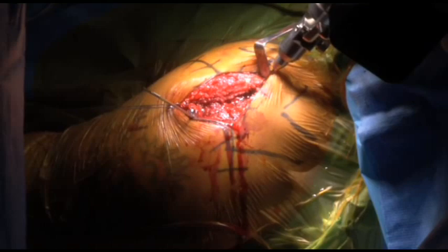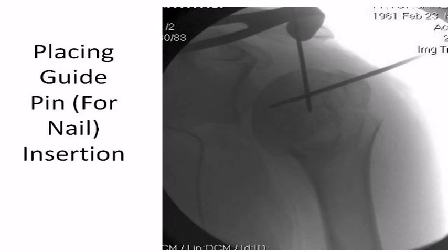Once the adequacy of the reduction is confirmed, a guide pin is placed through a small longitudinal incision made through the superior muscular fibers of the rotator cuff, medial to the cuff insertion. Alternatively, the guide pin can be placed directly through these muscle fibers, akin to placing an arthroscopy portal through the rotator cuff musculature. An awl or arthroscopic 9mm reamer can be used to make the pilot hole for the nail in the humeral head.